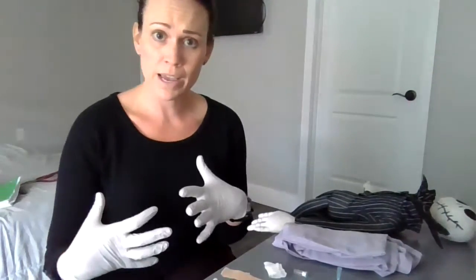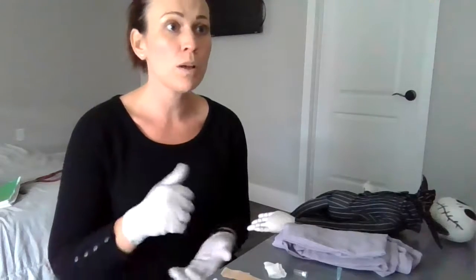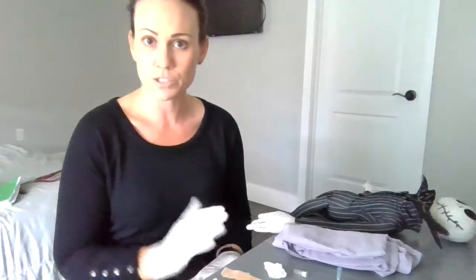So once I've collected my materials, I'll go ahead and enter the patient's room. I'll knock, I'll introduce myself. Hello, Mr. Skellington. My name's Kate. I'm with the respiratory care team here at the hospital. Today it looks like Dr. So-and-so prescribed an order. We need an arterial blood sample from you to check your oxygen levels in your blood, okay?